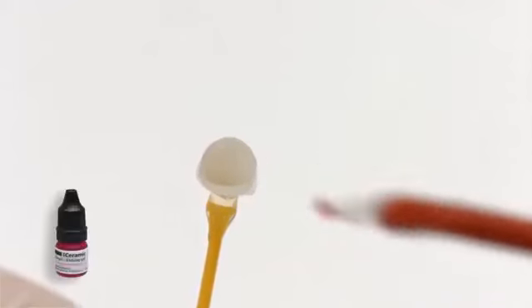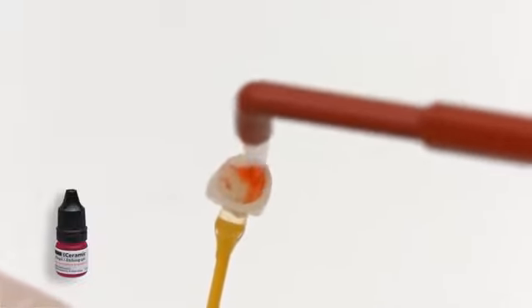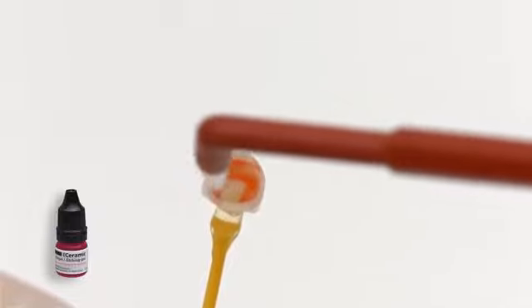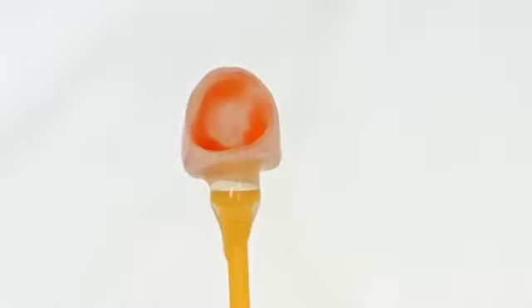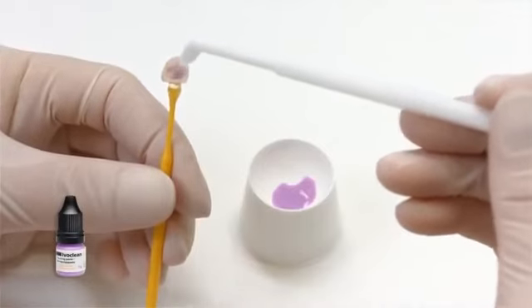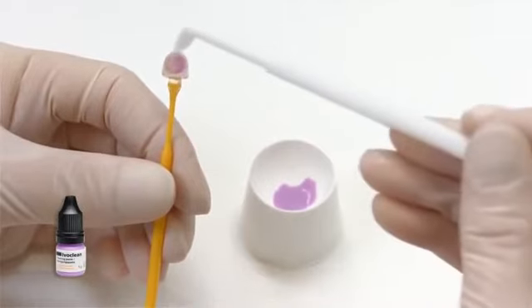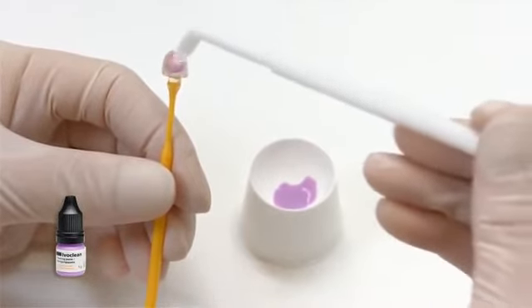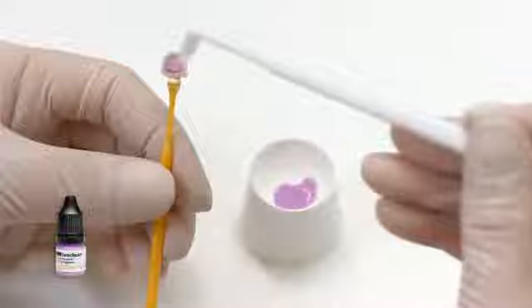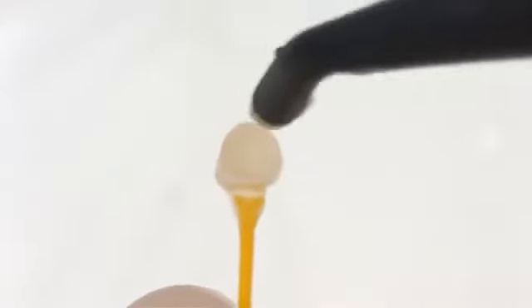Etch the bonding surface of the IPS e.max restoration with 5% hydrofluoric acid, for example ceramic etching gel, for 20 seconds. Rinse off the etching gel and dry the restoration. If the restoration was etched in the laboratory, clean the bonding surface with Ivoclean. For this purpose, apply Ivoclean to the entire bonding surface and leave it to react for 20 seconds. Then rinse off Ivoclean and dry the restoration.